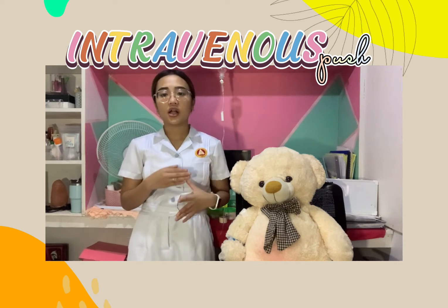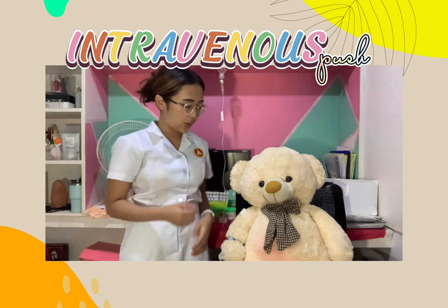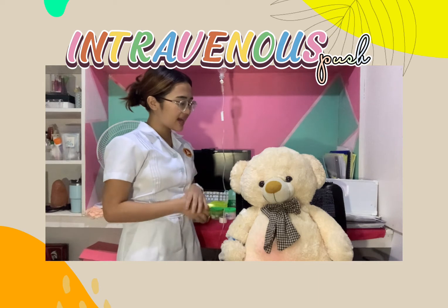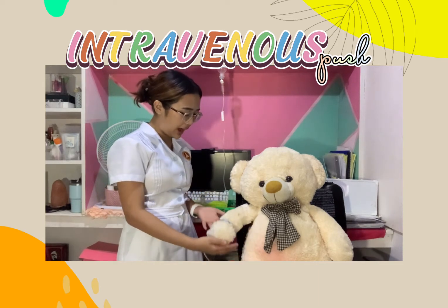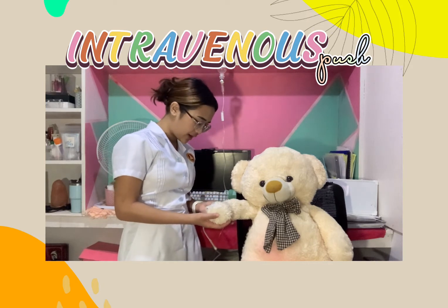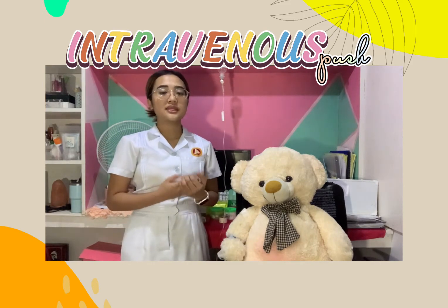And then we will also assess the patency of the IV line. Ma'am, may I assess the patency of your IV line po? Titignan ko lang po, ma'am, if there is any swelling or if the IV line po is still patent. Okay po. After that, we will now proceed to the planning.